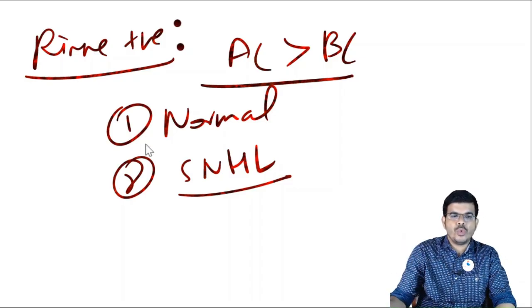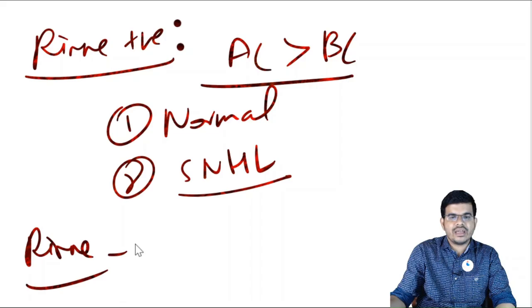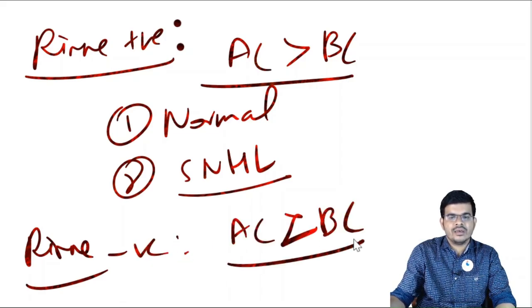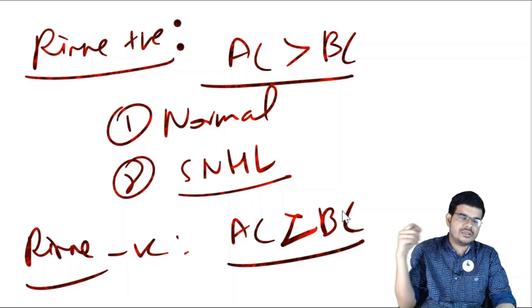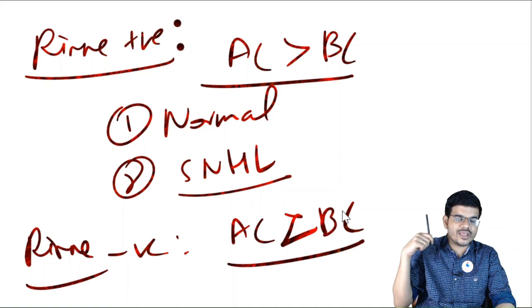So if there is sensorineural hearing loss, air conduction will be more than bone conduction. So these are the two implications of Rinne being positive. When Rinne is negative, it means that air conduction is less than bone conduction. That is, when you compare the loudness, the loudness is less when the air conduction pathway is checked, that is when the tuning fork is kept 2.5 centimeters from the external auditory canal, in the acoustic axis in the same plane as the anatomic axis of the external auditory canal.